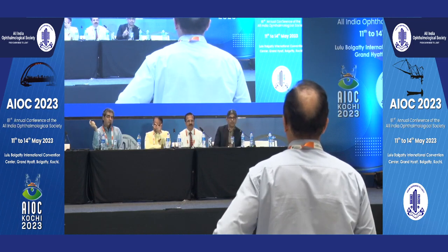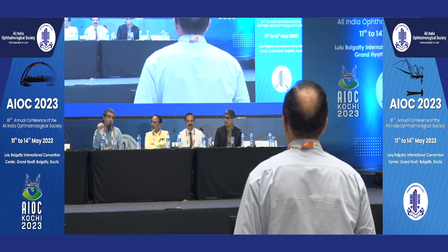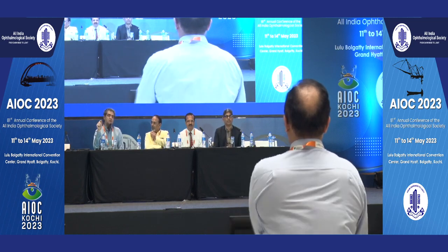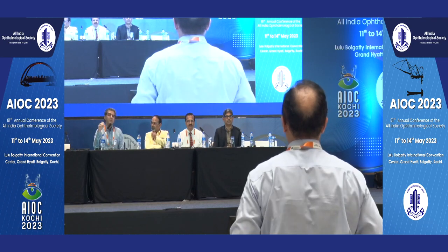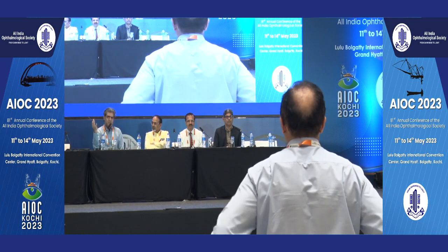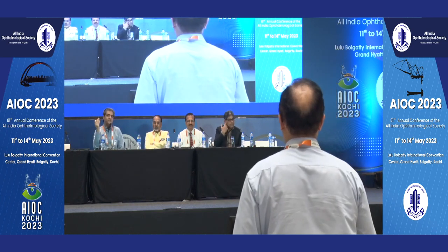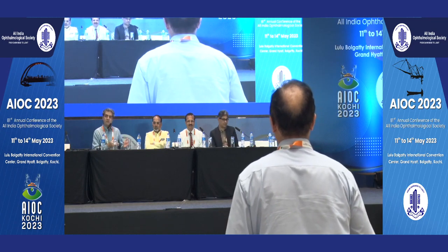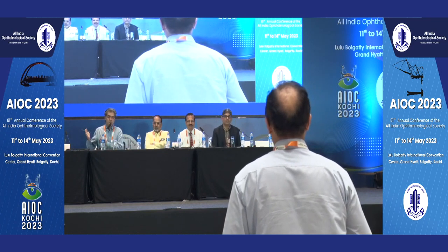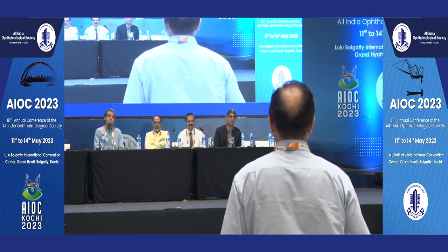In case you noticed, I was showing my Varion, that there were marks on that video. It was just because it was in the earlier times. Now the software of the Varion has been upgraded. The chances are almost negligible. I won't say 100%, but maybe once in 6 months you'll have that situation. Maybe I haven't had that after the upgrade. But before the upgrade, which came about 5 years back, we were marking all our cases. We used to do it earlier.